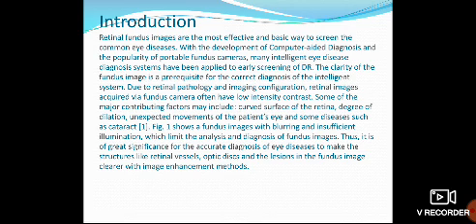The retinal fundus images are the most effective and basic way to screen the common eye diseases. With the development of computer aided diagnosis and the popularity of portable fundus cameras, many intelligent eye disease diagnosis systems have been applied to early screening of DR. The clarity of the fundus image is a prerequisite for the correct diagnosis of the intelligent system. The above figure shows fundus images with blurring and insufficient illumination, which limit the analysis and diagnosis of fundus images.